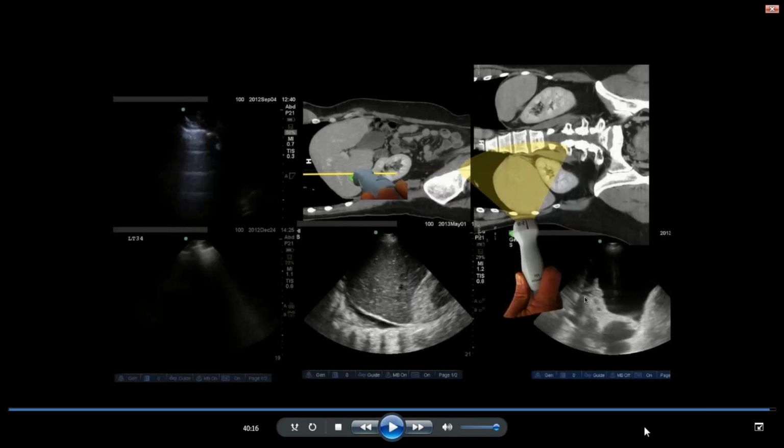there are some great articles on this topic. One of the foremost authorities in the world is from Europe, Germany, I believe, Dr. Mathis. He is very adept with pleural ultrasound. And in 2012, there was a nice article that came out of the University of Indonesia by Dr. Rumende, and I'm probably completely distorting that last name. That depicted lung ultrasound use in pleural diseases and specifically mentioned asbestosis, mesothelioma, and pleural-based tumors.